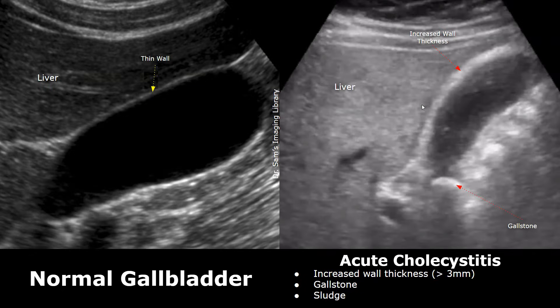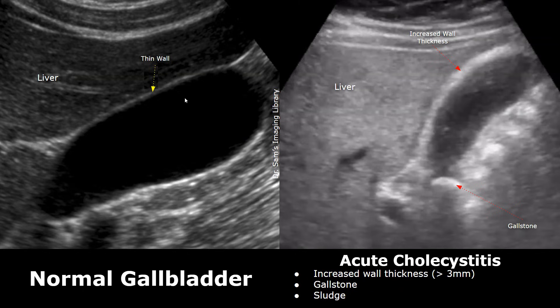Here is a case of acute cholecystitis with a hyperechoic gallstone present in the neck. Posterior shadowing is also present. Sludge is present as well — low-level echoes are noted in the lumen. The lumen appears hazy due to this sludge. It is not clear like it is in the normal image. The gallbladder wall appears abnormally thick. All these features indicate acute cholecystitis.